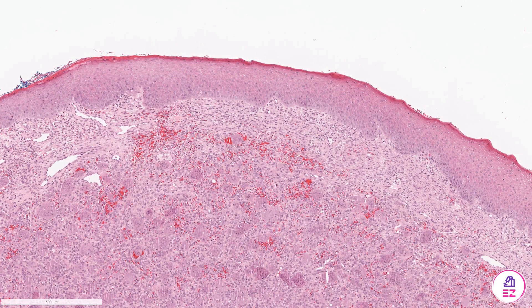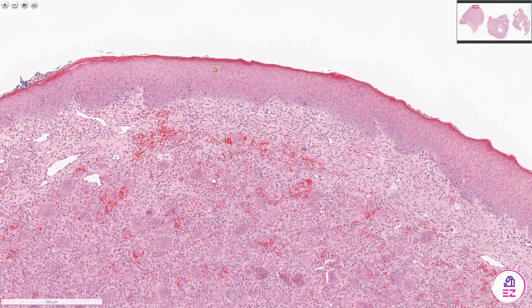Hello and welcome to Path Made Easy. Today we have a case of a peripheral giant cell granuloma. On the surface of this biopsy we have parakeratinised stratified squamous epithelium, but I'm not going to talk about that anymore because the area of interest is in the underlying connective tissue.